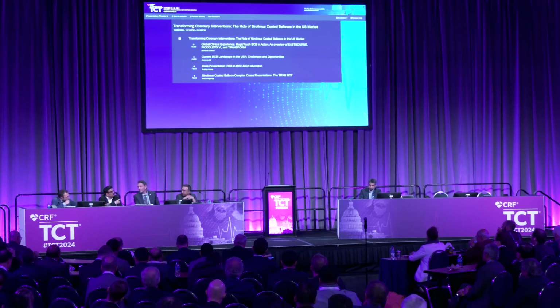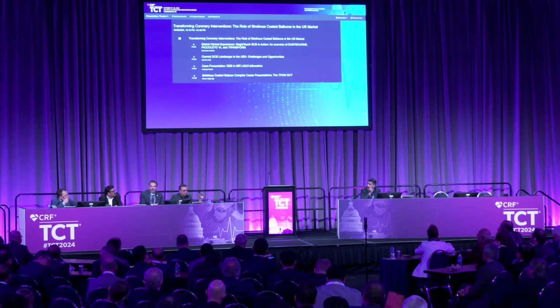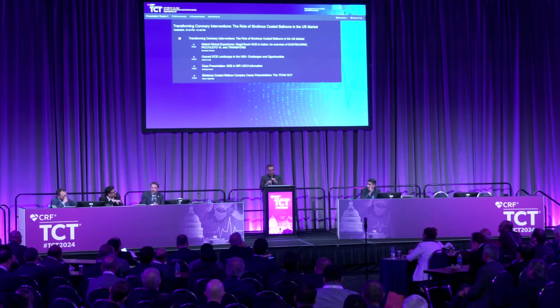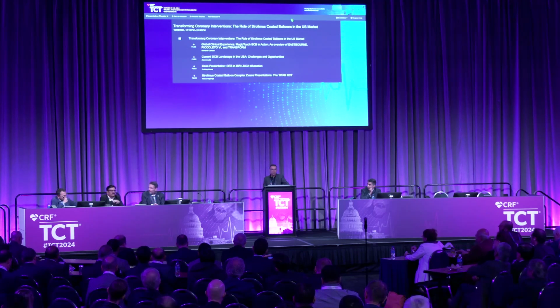Bernardo, I have a doubt. You said that if you have significant dissection, they do better than with no dissection. Can you explain? We have learned this clearly from some Japanese studies, but also from European studies. The more you dissect, the better it is, but the dissection cannot be a flow-limiting dissection, otherwise you will have an acute problem. Is it actually an image-guided study? Yeah. That's an OCT study by Yamamoto. It's a very nice, well-performed study.